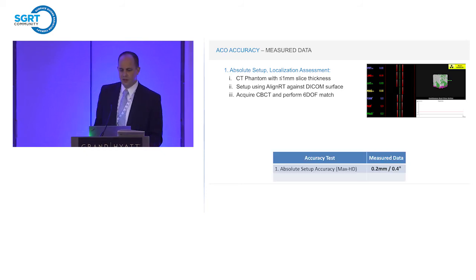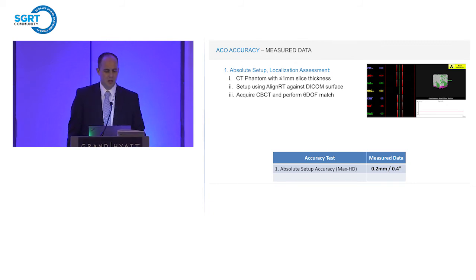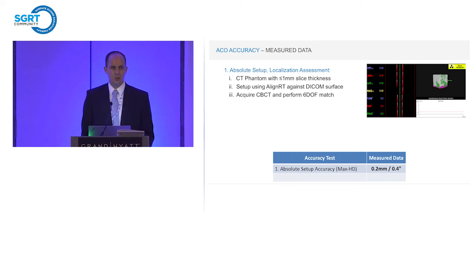And the results were, for the Max HD phantom, the absolute setup, we were able to position this phantom to within 0.2 millimeters of the CBCT confirmation and 0.4 degrees. So that's units of millimeters. That's, I think, extremely tight. For the cube, which is a slightly more straightforward phantom shape, we could get it within 0.2 millimeters, 0.2 degree accuracy.